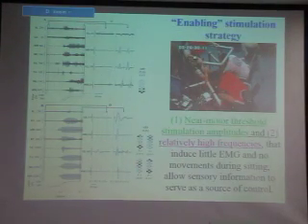And this is, to me, one of the most important slides of this presentation, because it shows two individuals during the sitting to standing transition. You can see that for both of them, at the beginning, when they are seated, there is little or no muscle activity. Then, without any change in the stimulation parameters, just the transition from sitting to standing drove this change in motor patterns that led to an actual ability to stand.